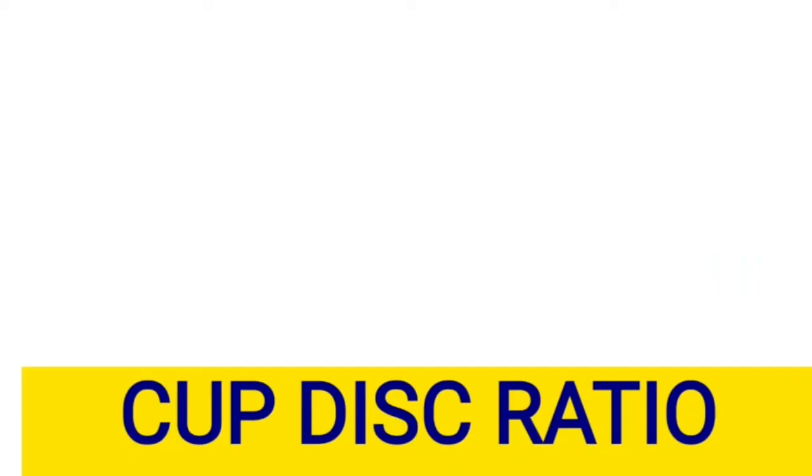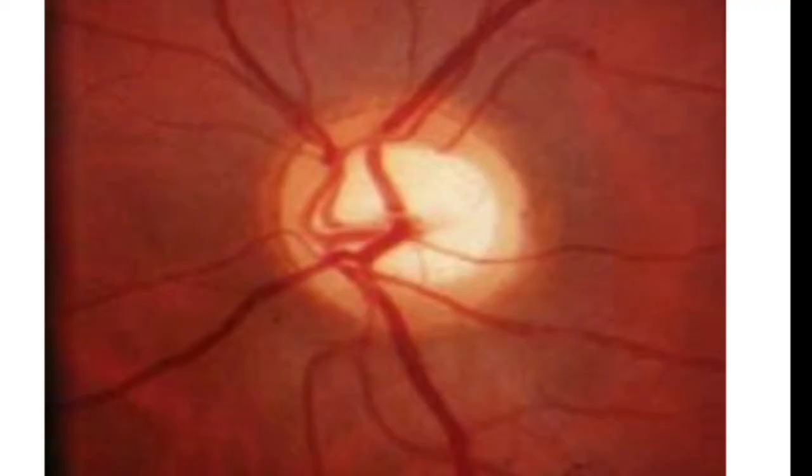Optic cup can even be transient and reversible in the case of the pediatric age group. Next, coming to the cup disc ratio. This is a frequent word which you hear when you are discussing any glaucoma patient. So what is the cup disc ratio? This is the ratio of the size of the cup to the size of the optic disc, and the normal cup disc ratio is 0.3.